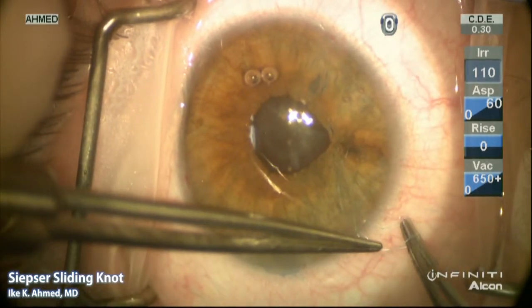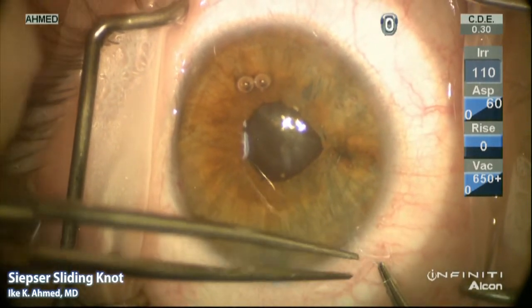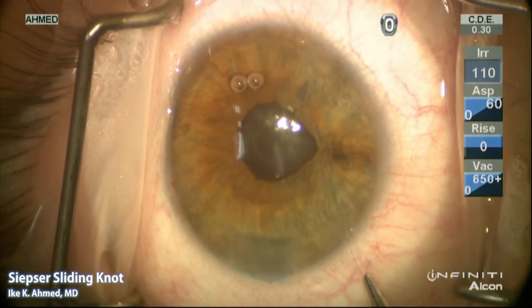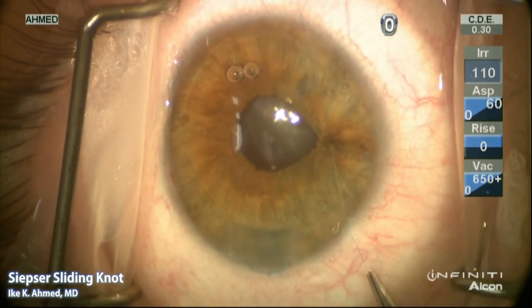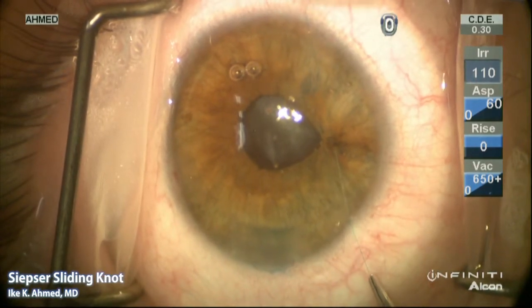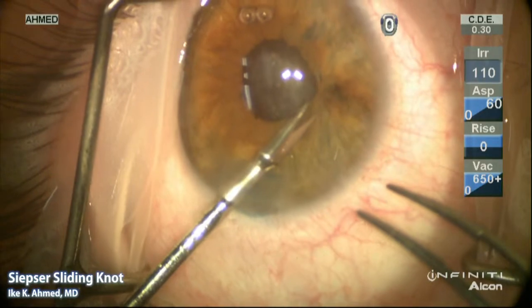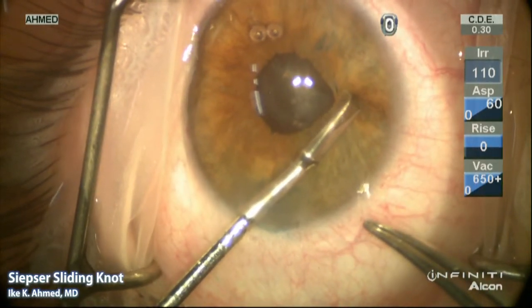We now make the final single throw to secure the lock. The distal strand is pulled to slide the loop along the proximal strand. We now have a secure knot. A pair of micro scissors are used to cut the suture ends.